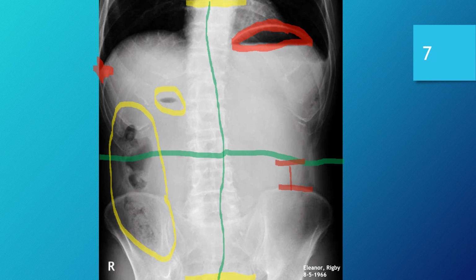But to me, the exposure properties for this image are off just a bit. If there was an adjustment made, it needs to be reset. Because the differences in the tissue in the central portion of the belly are definitely off a little bit. They're very diffuse, and there's very little detail that can be determined about the rest of the patient's belly.